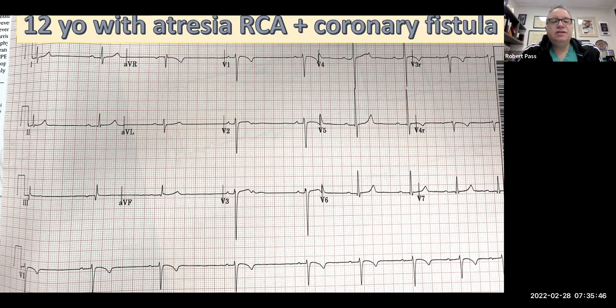I did send the patient a ZIO monitor to see what's going on with the rhythm over long periods of time. I probably should have sent those other tests, but I did not in this patient. But it's an interesting observation in somebody who might potentially have right coronary perfusion issues. So I thought this was interesting to share.